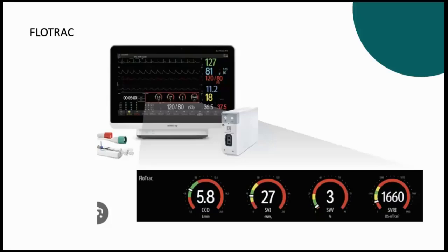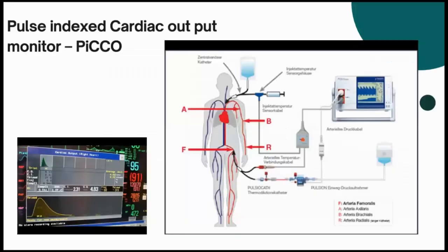So the next monitor that we have is the PiCCO. This is the pulse index cardiac output monitor that we have. We use the thermodilution technique. It is incorporated into a Philips monitor. It is at the moment living in the ICU, always plugged in and charging. So it is a little invasive.